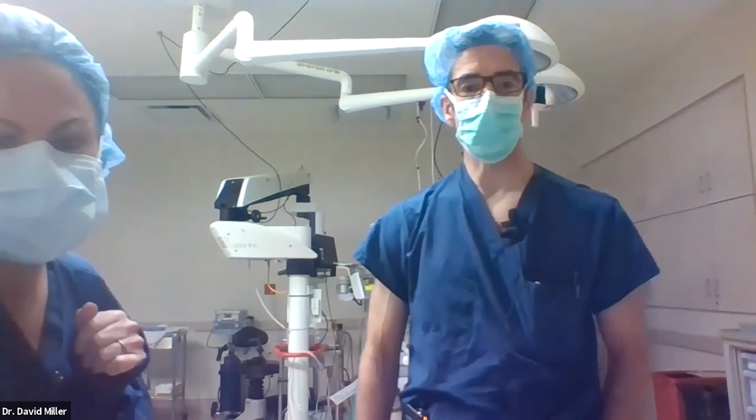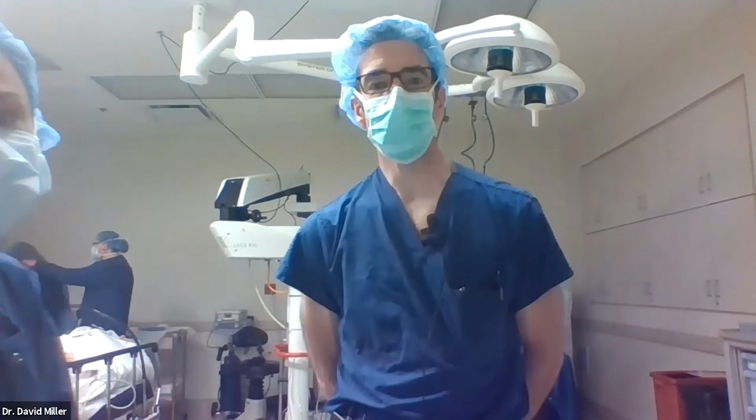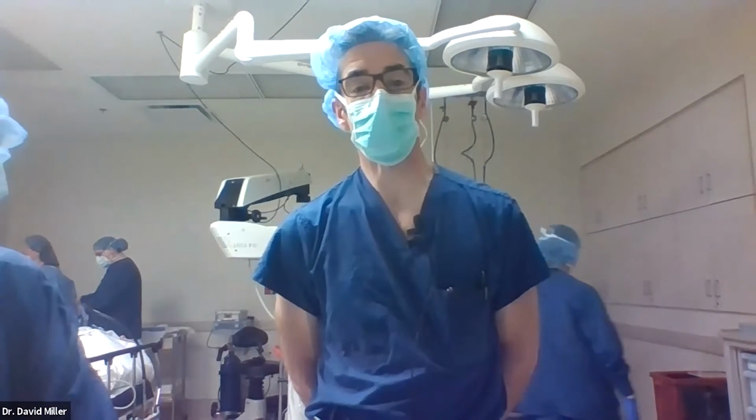Yeah, let's do the Q&A while we're kind of hanging out here. How much gas or silicone oil do you inject? Any criteria for that? If we were using oil, it'd be great to show you that technique. What we do with the oil is we fill it up to the infusion cannula, so it's just coming back up the infusion line. So the posterior segment's probably 90% full with oil. Gas, same, probably more than that, 95%.